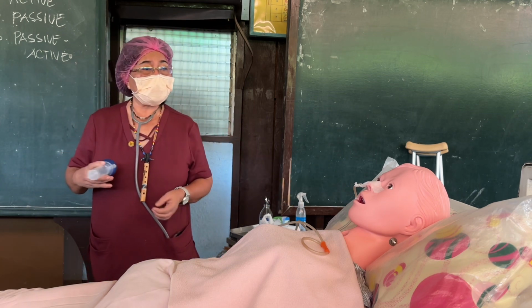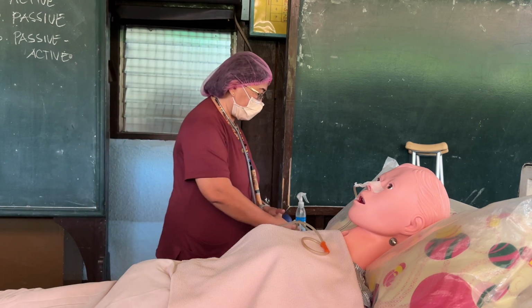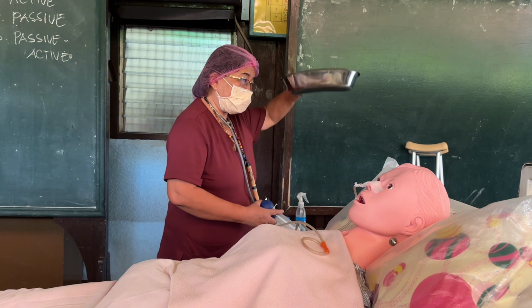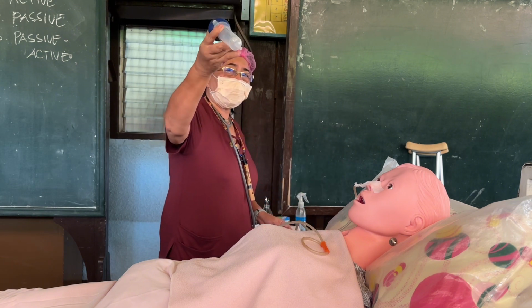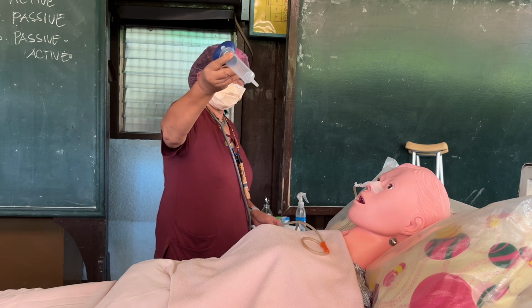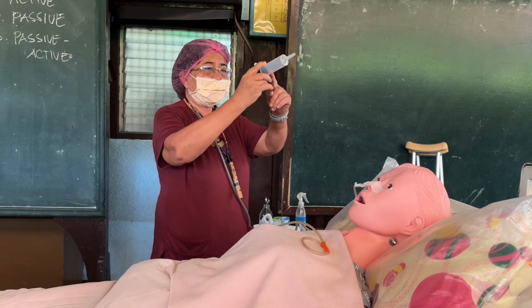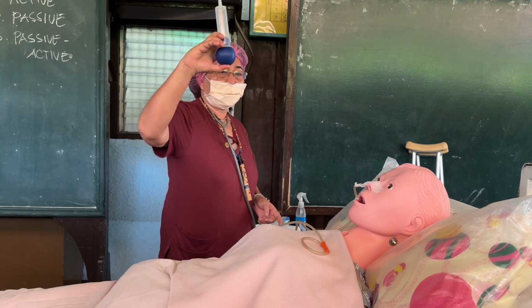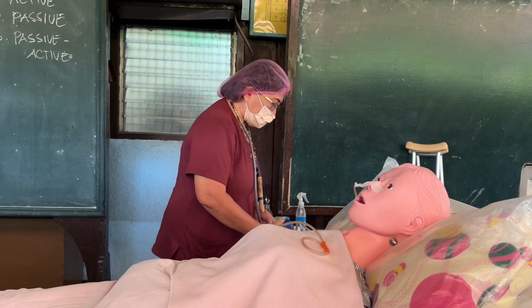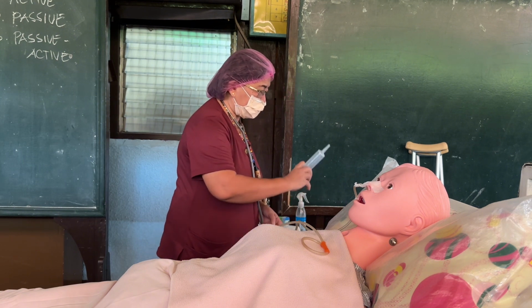Now I'm going to aspirate. When I aspirate the water, I press it, the PNSS goes down, and when I release, the gastric contents come up. Aspirate, PNSS, then release.